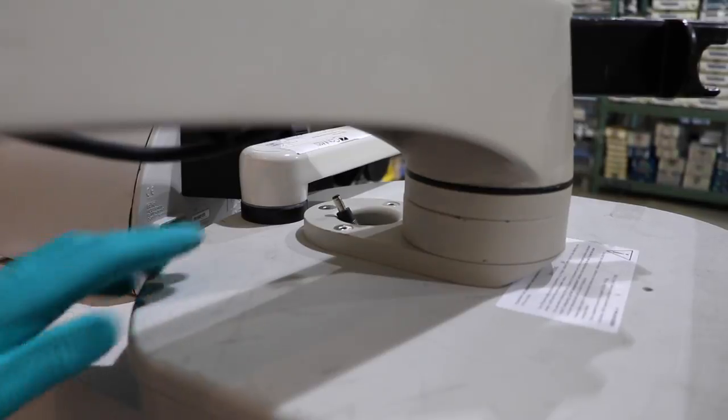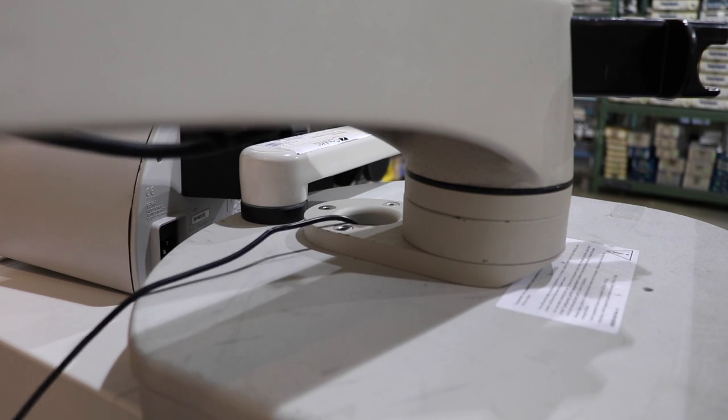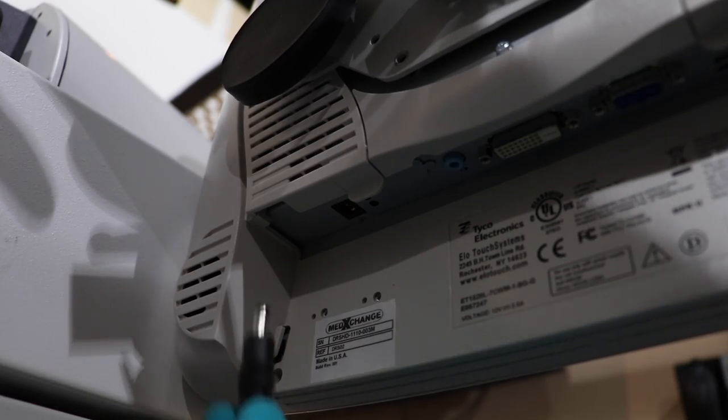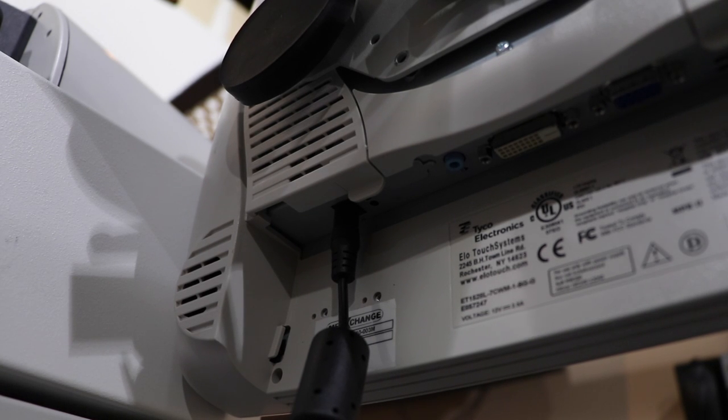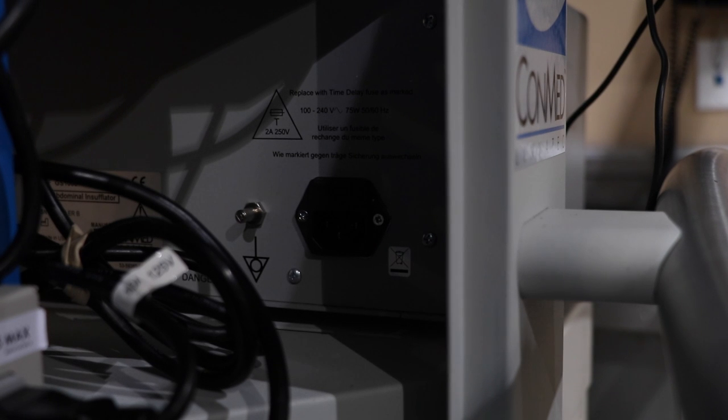Let's feed that up through the center hole as well and plug it into the back of the DRS02. Let's go ahead and plug in our power for the D4000. Now let's take our power for our GS1000 and plug it in.